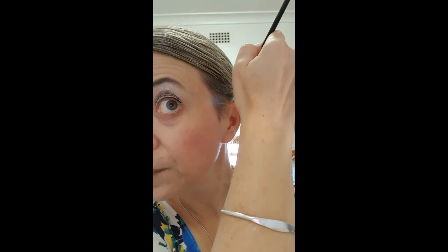Now, for the last bit, this is a blush that I had to match for my ear. I bought it at a pharmacy or a makeup shop, but it was quite a challenge to find something that matches my ear exactly. And it must also not be shiny, because like makeup on my eyes, else my ear will shine. So I use a little makeup brush. And now you'll see the moment I start dabbing the powder on. It's sticking a bit out of the back of the ear, but luckily nobody's going to look at the back of my ear.